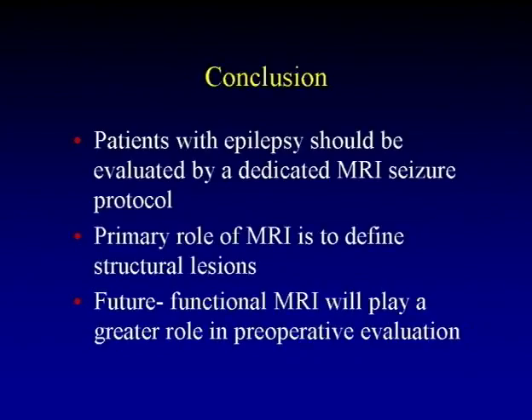So in conclusion, patients with epilepsy should be evaluated by a dedicated MRI seizure protocol. The primary role of MRI remains to define structural lesion. And in the future, functional MRI will certainly play a greater role in the preoperative evaluation of these patients.